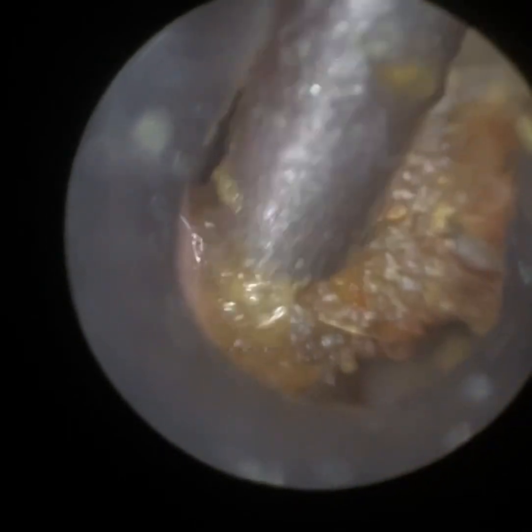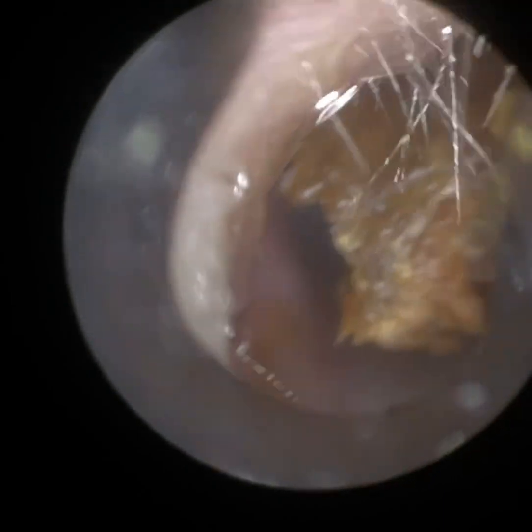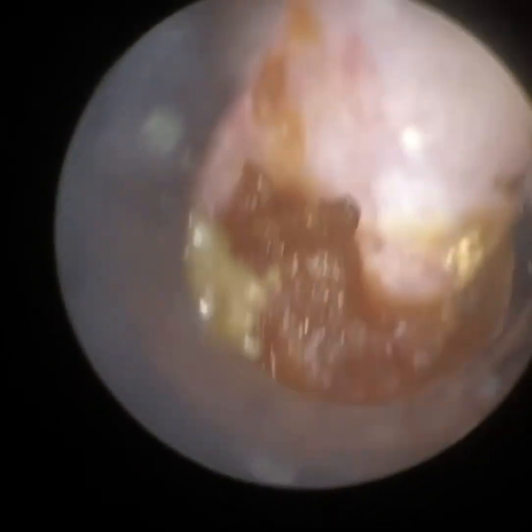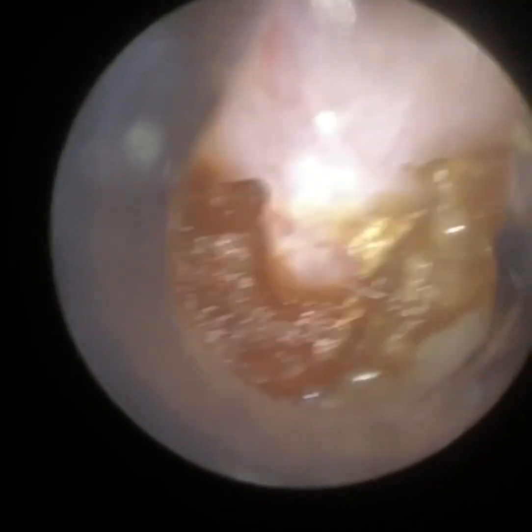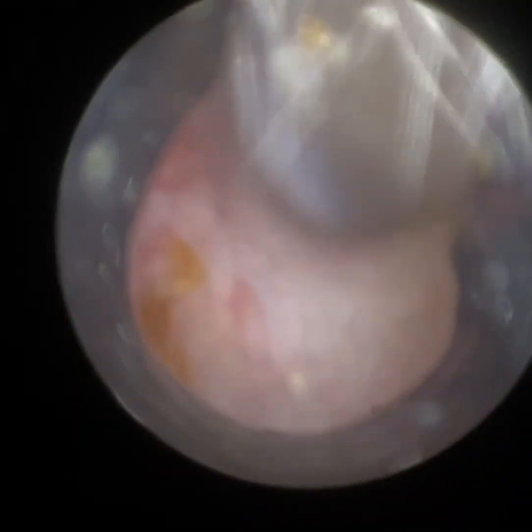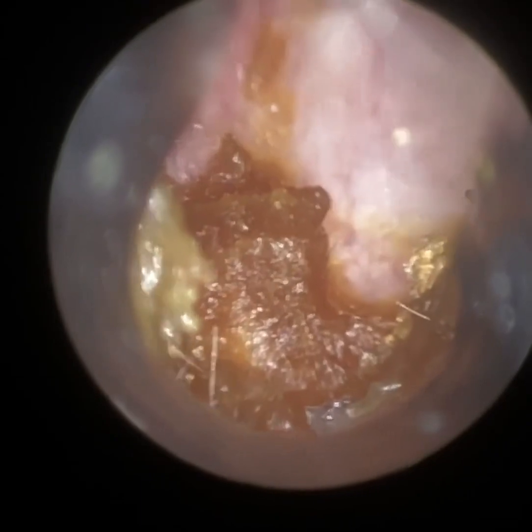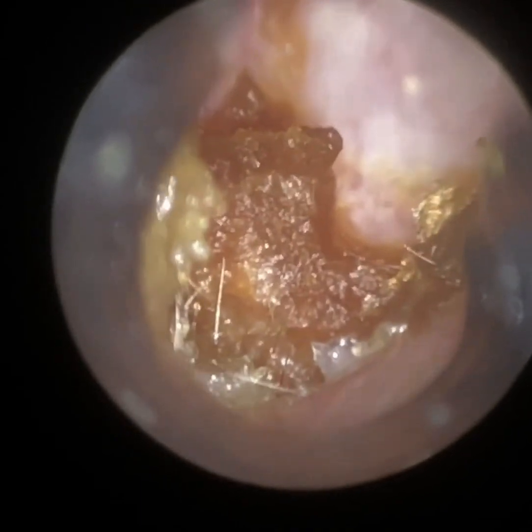You can see I've put the olive oil spray on, and it's just changed the whole consistency — it's made it much easier for me to vacuum. Now I'm just going to slowly wriggle this out of the ear. A 4.25mm specular is more than adequate. We do have a smaller size, a 3.5mm, and we've also got two larger sizes, a 5mm and a 5.75mm, but I think the 4.25mm is going to be the most commonly used one.